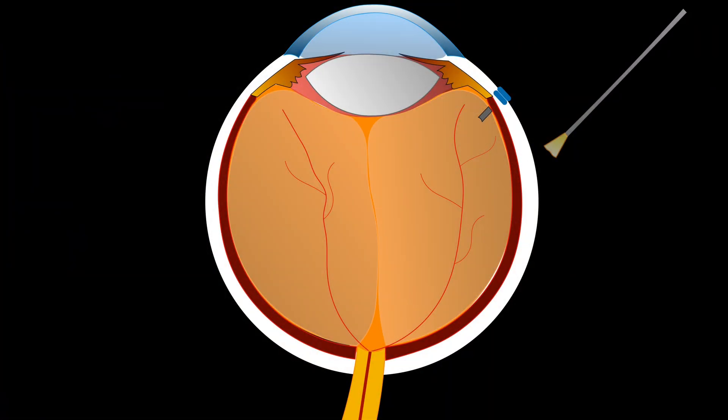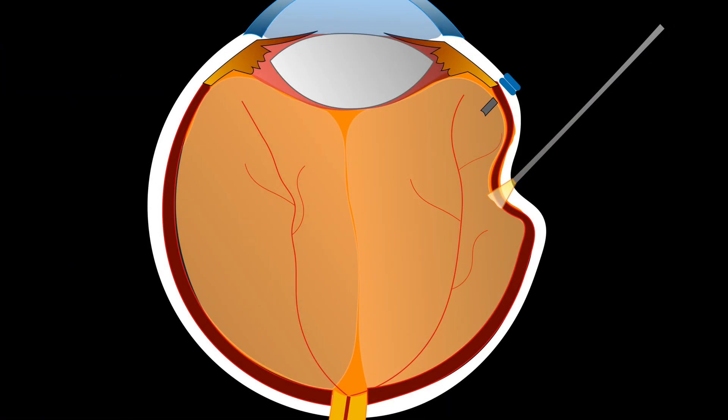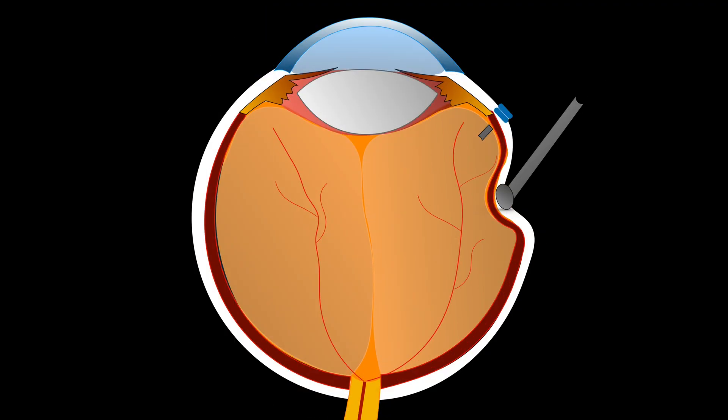To improve the contrast and enable better visualization of the peripheral vitreous, you can use trans-scleral illumination at the point of indentation. Some surgeons use the illuminator probe itself to gently depress the sclera. However, the blunt tip of the sclerodepressor allows a more effective and controlled indentation. So, you can hold both instruments — the sclerodepressor and the illumination probe — together to perform trans-scleral illumination and allow safer peripheral shaving of the vitreous base.